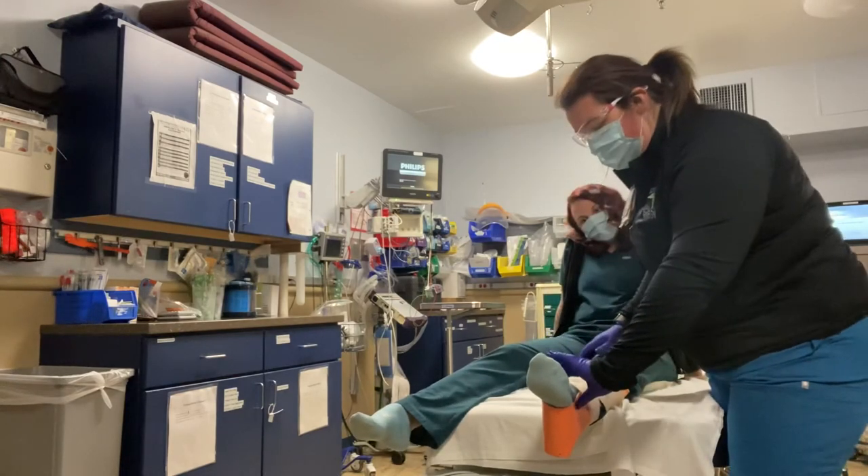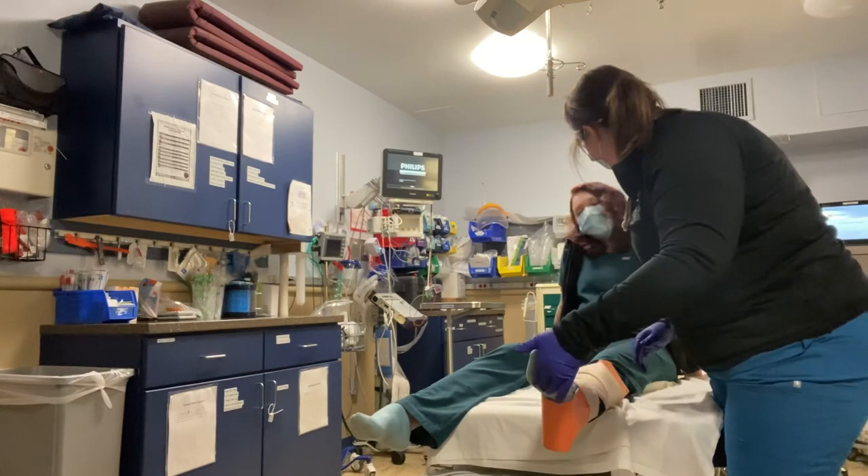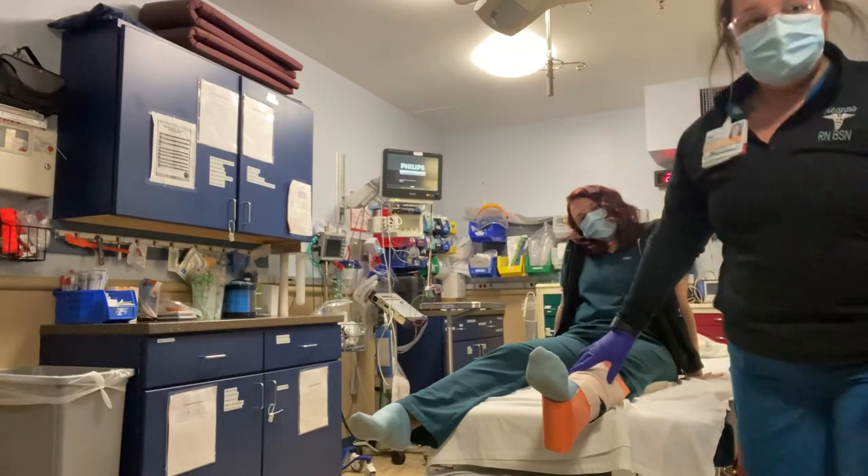I'm going to check her pulse again. Can you feel my fingertips? Yes. So now I'm going to transport to the hospital.